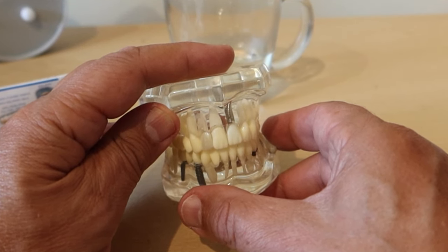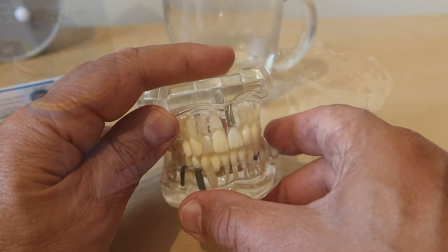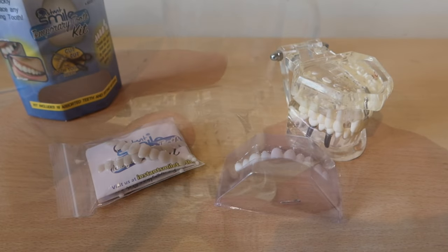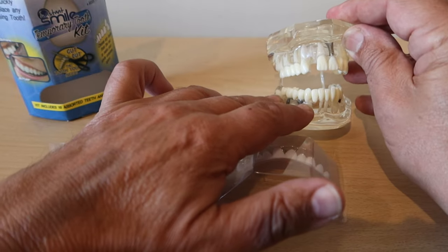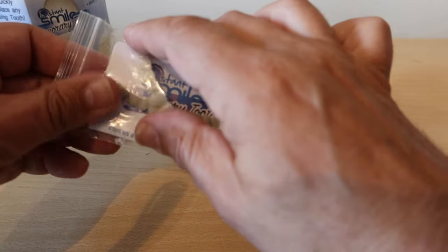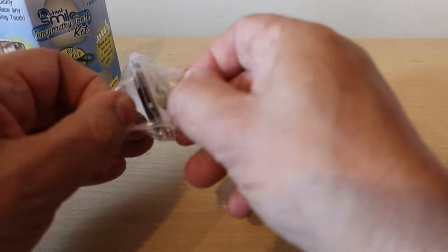If it does come out, you just reheat the beads and you can start again, or reposition if you're not happy. I personally wouldn't sleep with this in at night — I'd be worried about swallowing it — so I'd probably take it out and reapply in the morning, but that's very much up to you.